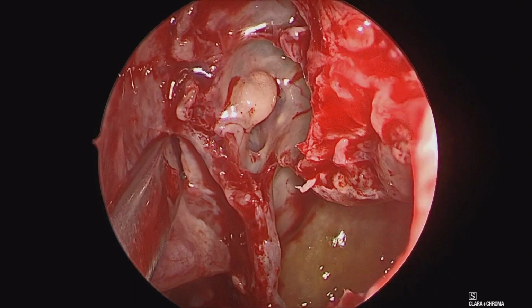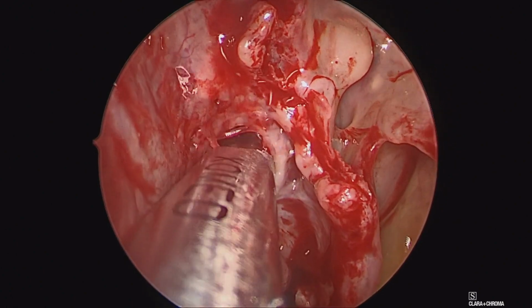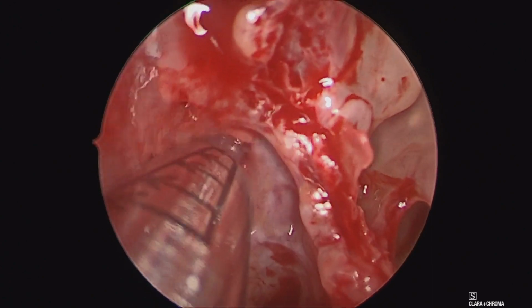As we dissect through this area, it's important that we again delineate the tumor, and we're going to remove the basal lamella to facilitate our access posteriorly, but keeping the tumor intact so we can carefully dissect that and further identify its higher attachment points.